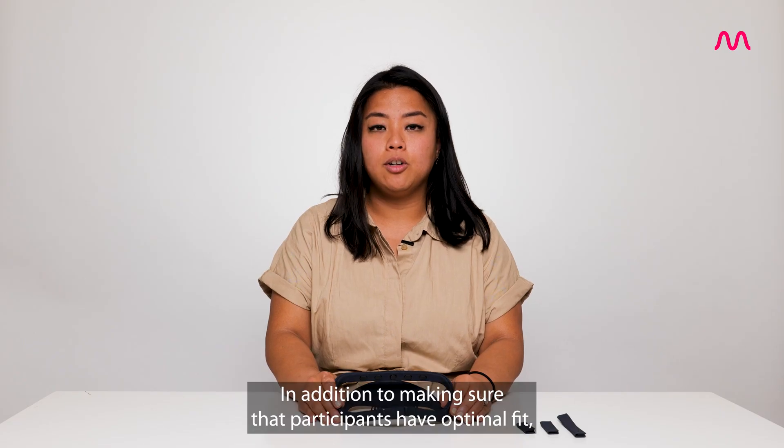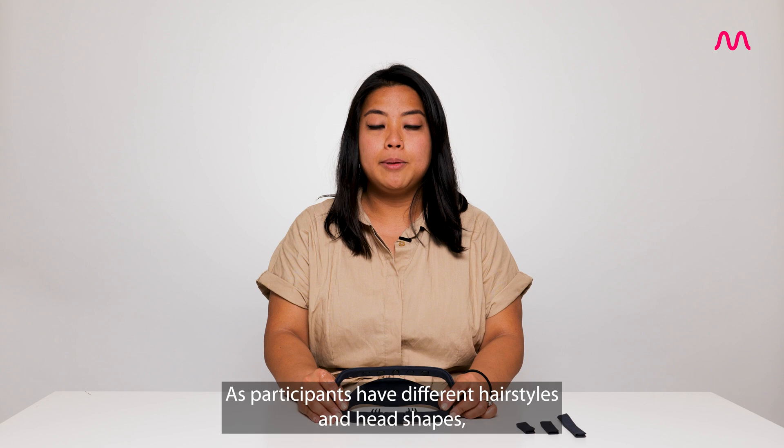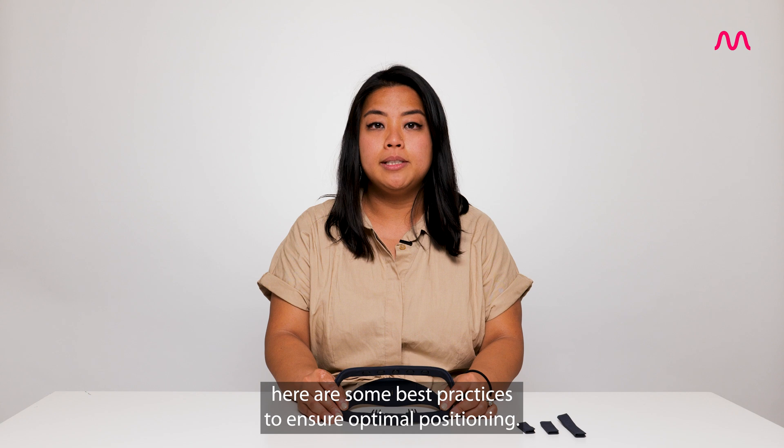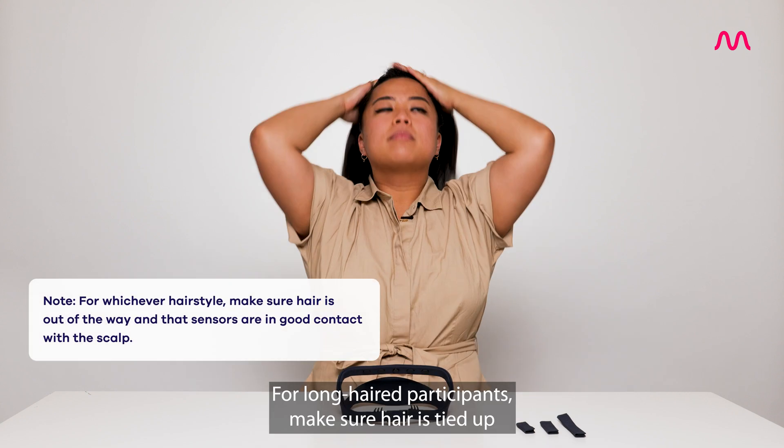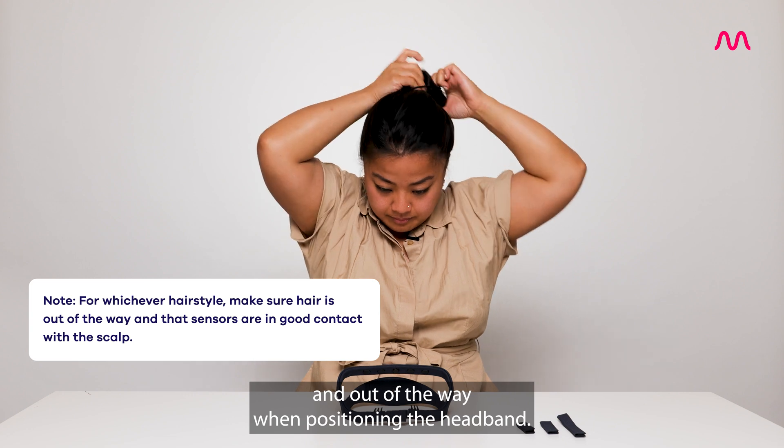In addition to making sure that participants have optimal fit, it is important to make sure that the headband is positioned properly. As participants have different hairstyles and head shapes, here are some best practices to ensure optimal positioning. For long-haired participants, make sure hair is tied up and out of the way when positioning the headband.